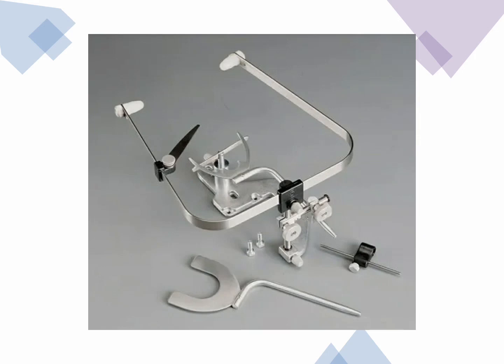These two serve as the two posterior reference points, and this is an orbital pointer which is used as the anterior third point of reference, and this is the U-shaped frame which extends from one side of the face to the other side, and this is the bite fork, or the stem. This bite fork has to be seated or inserted into the occlusal rims and placed intraorally for recording the orientation jaw relation. And then we have the transfer jig assembly, which is used for transferring to the articulator.